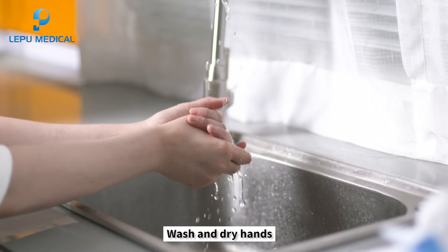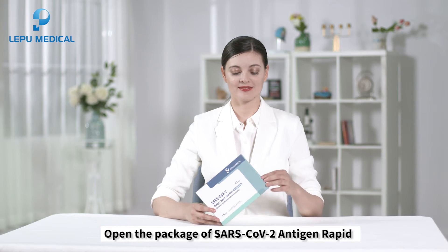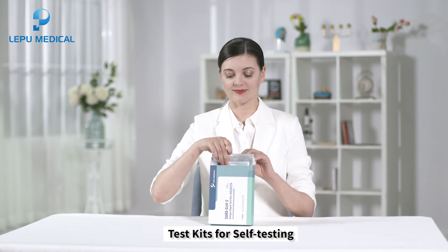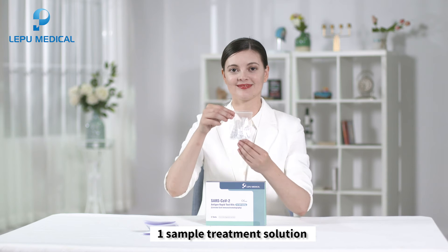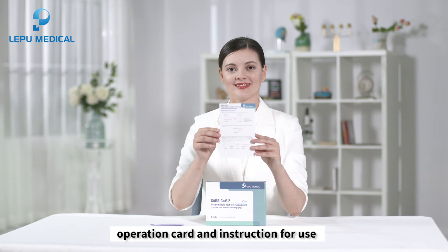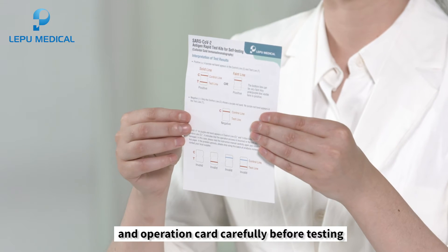Before the test, wash and dry hands. Open the package of SARS-CoV-2 Antigen Rapid Test Kits for Self-Testing. Take one test card, one disposable sterile swab, one sample treatment solution, operation card, and instructions for use. Read the instruction for use and operation card carefully before testing.